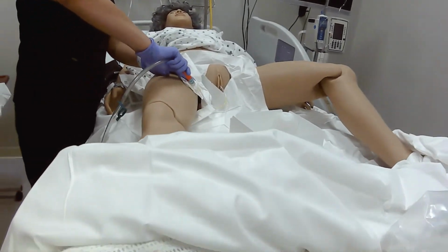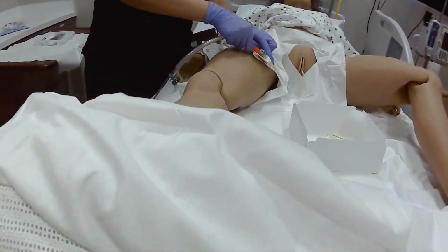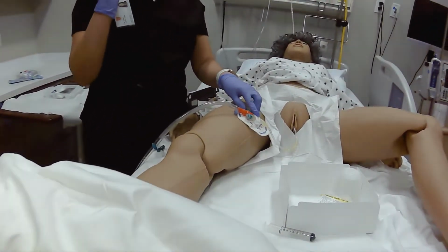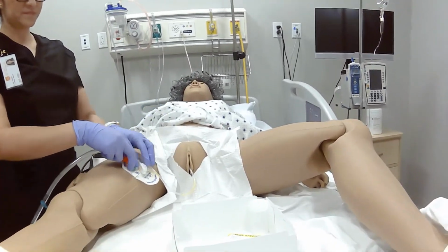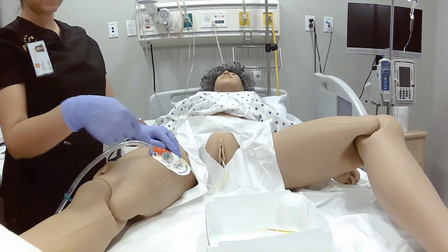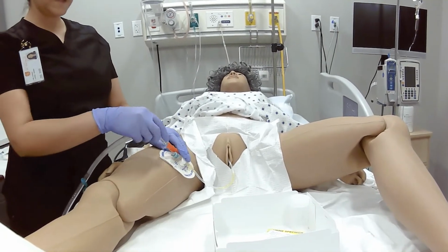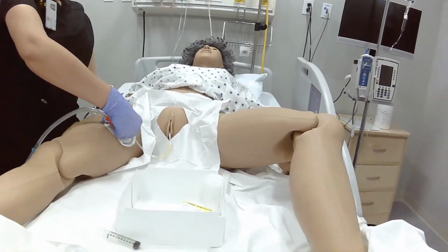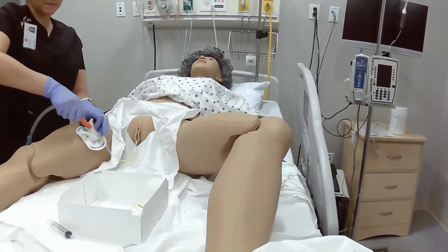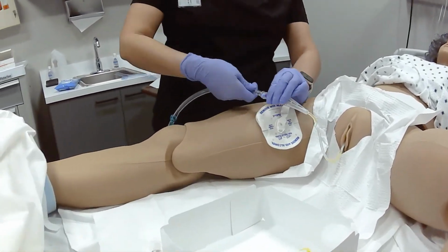Now, another important thing to remember is when you have to collect a urine specimen from the urine that you just got from the Foley, most Foley catheters will have a port, okay?